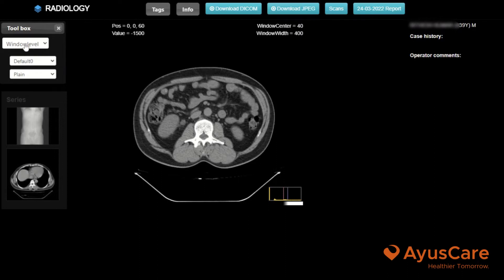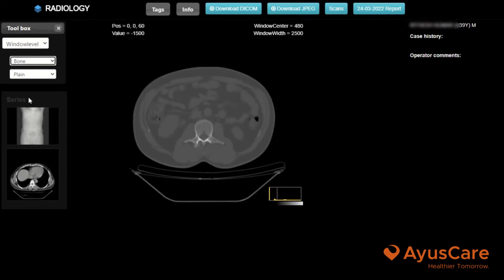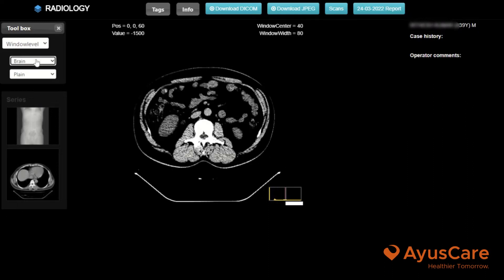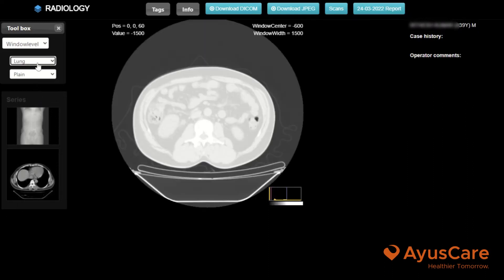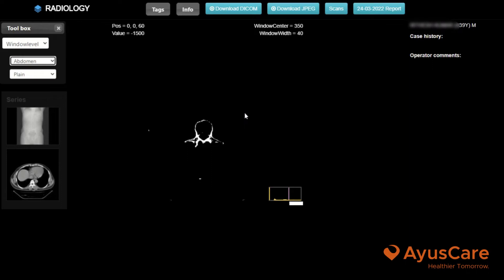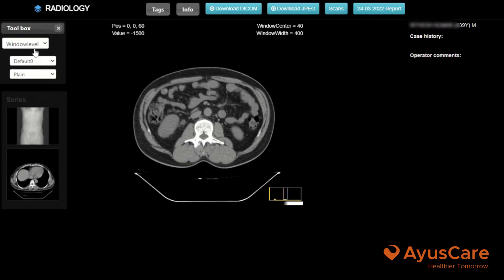In the window level, you have multiple options to check, like bone view, brain view, lung view, abdomen view, and default view.